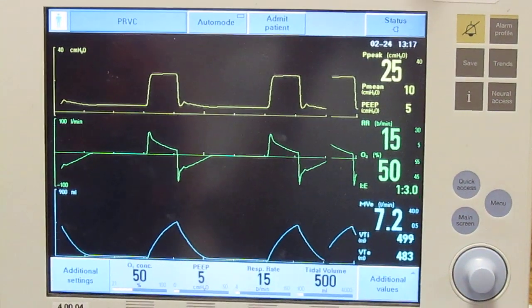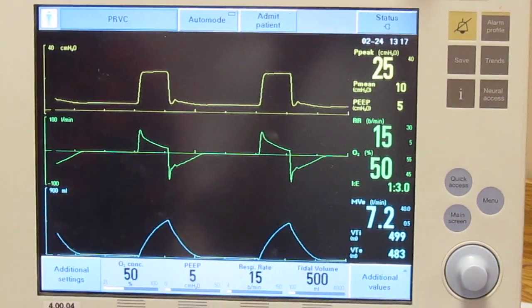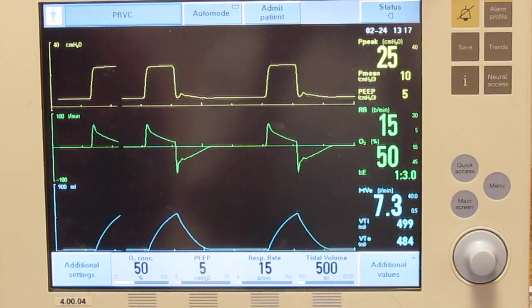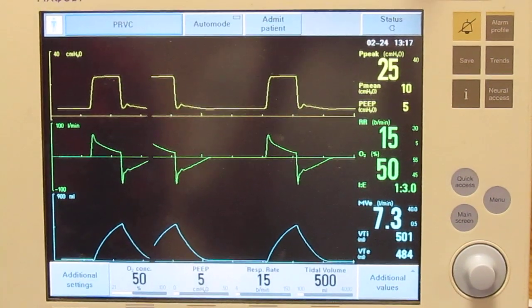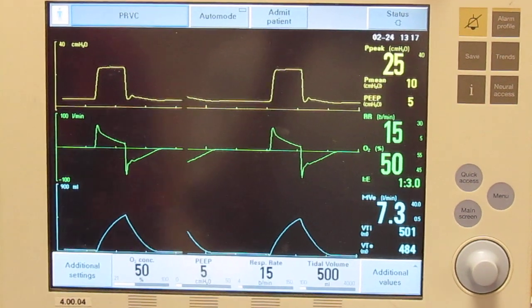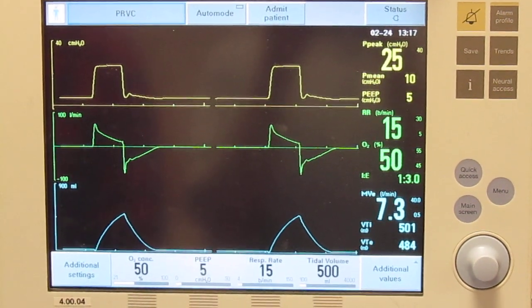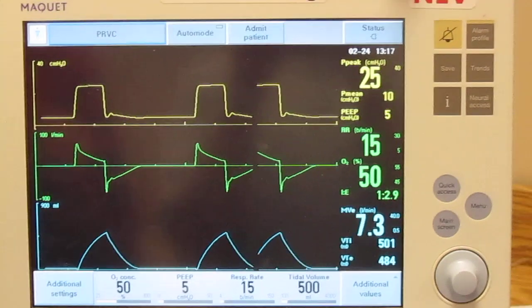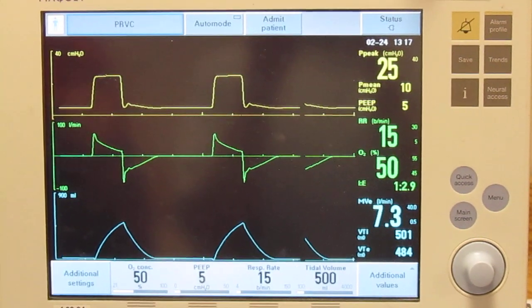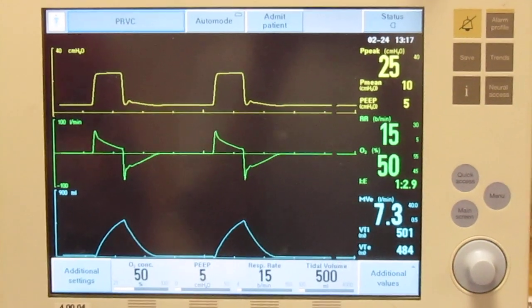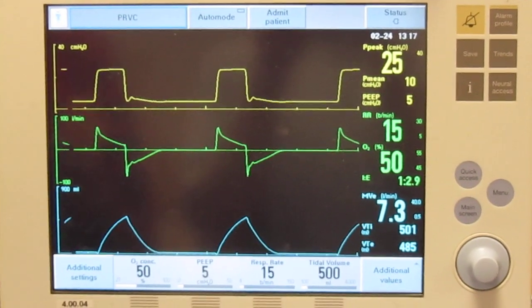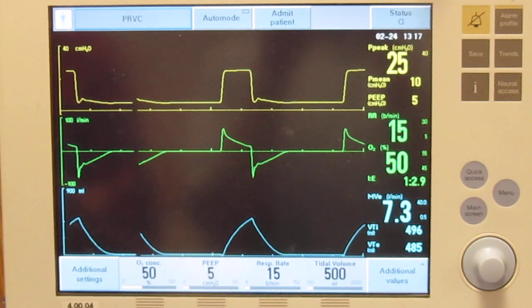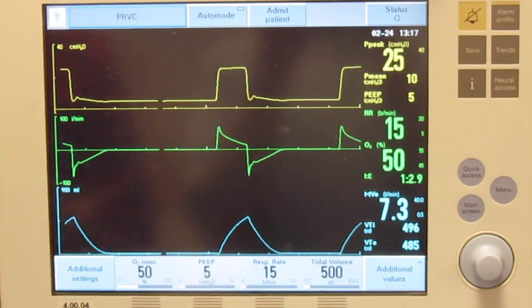So we went over mandatory breaths. We are going to go over some patient-triggered breaths now. As you can see, it's just going through the mandatory breaths right now. Patients can trigger a breath two ways — it can either be pressure or flow triggered, and we're going to show you both.